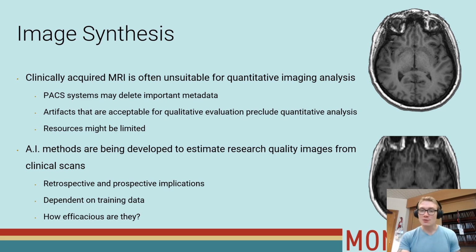On the right are two scans that I've used in my study. The top one is a gold standard 3D MRI, the bottom a low-resolution 2D scan of the same participant. Trying to work with 2D images can result in unreliable quantitative estimations or even pipeline-ending errors. For these reasons, a lot of clinically acquired data is neglected or considered unworkable for quantitative analyses. This means that there is a huge amount of MRI data that neuroimagers can't really use in its present state.